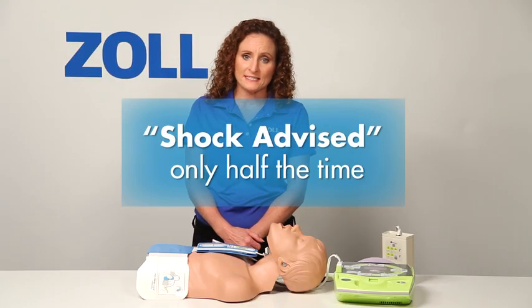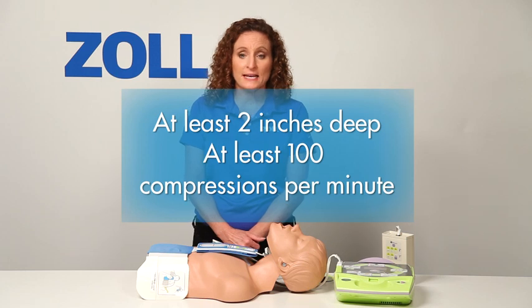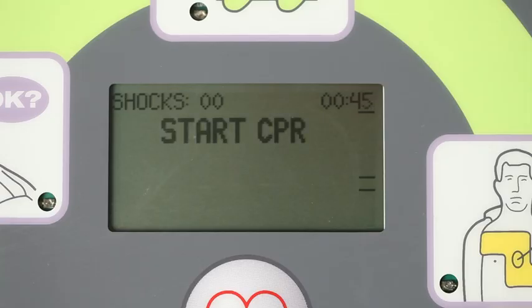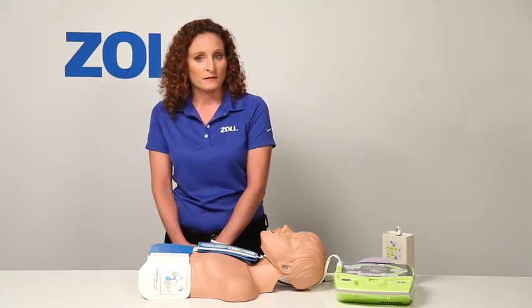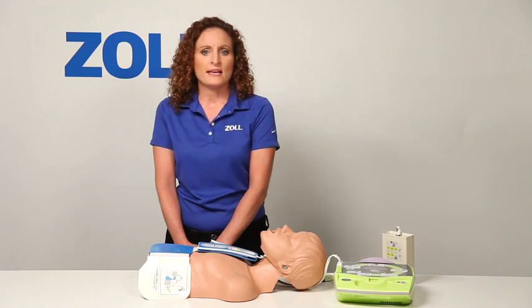Half of all rescues with an AED start with no shock advised. Perform good CPR with chest compressions that are at least 2 inches deep at a rate of 100 compressions per minute, and the next analysis may tell you to deliver a shock. The AED Plus repeats the prompt to start CPR every 10 seconds, because our AED has a technology called Real CPR Help. The AED Plus sees that I've not yet begun chest compressions.